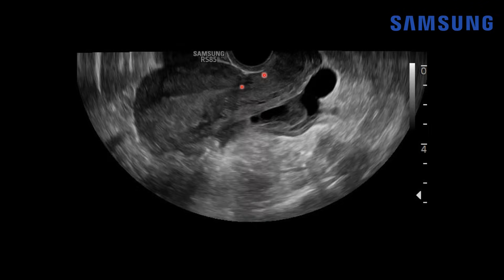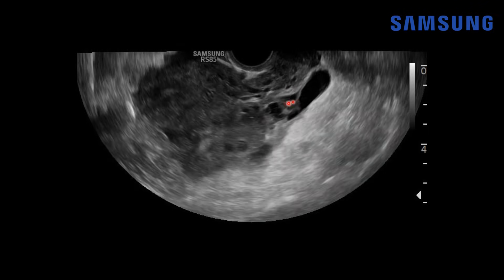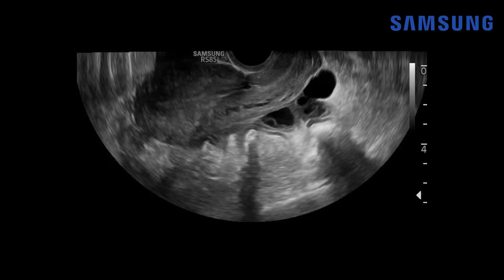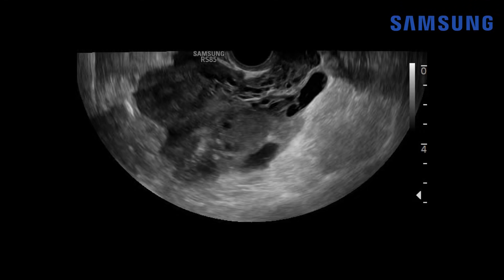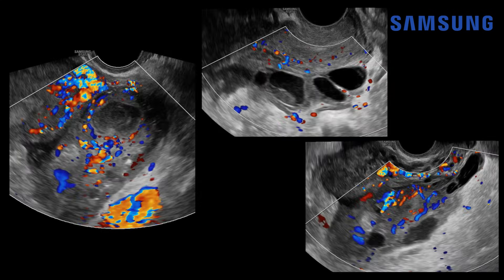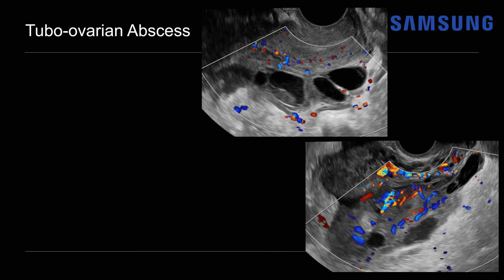On real-time imaging, posterior to the uterus we see the dilated fallopian tube leading into a complex adnexal mass-like structure with multilocularity, complex fluid, and no normal ovarian architecture. There's also complex fluid adjacent to the uterus within the pelvis. Adding color Doppler, we see very robust flow throughout, indicating hyperemia — rim hyperemia around the abscess pocket and around the inflamed dilated tube, much more than expected for a hydrosalpinx or even a piosalpinx in isolation. This is typical for a tubo-ovarian abscess.